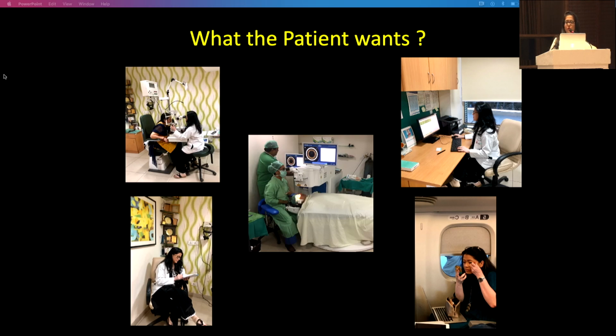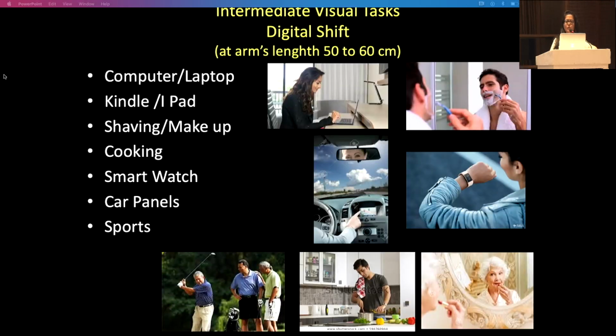So after this overview of all the presbyopic lenses, basically, the question is what your patient wants. All patients would want independence from glasses most of the time. One thing which has changed in the post COVID era, or let's say from the past few years, is the digital shift.